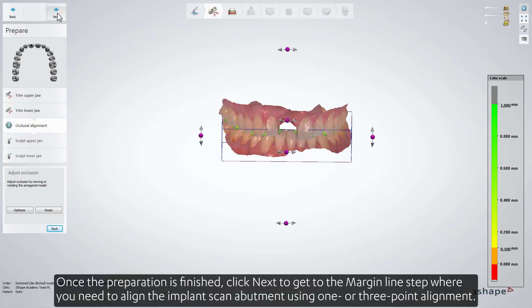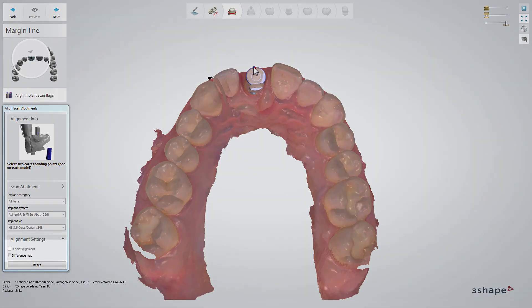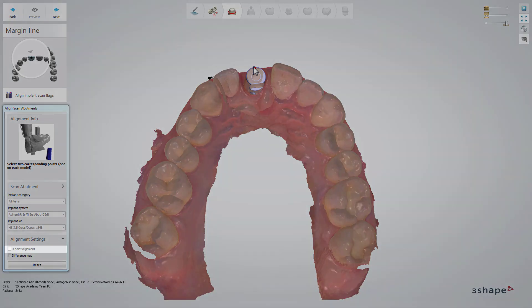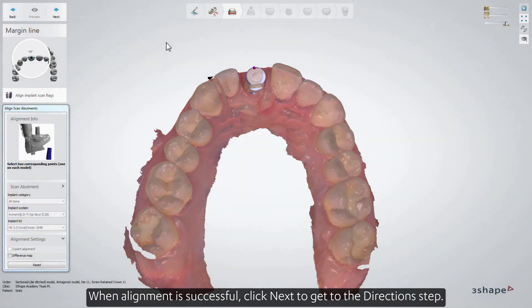Once the preparation is finished, click Next to get to the margin line step, where you need to align the implant scan abutment using one- or three-point alignment. When alignment is successful, click Next to get to the direction step.